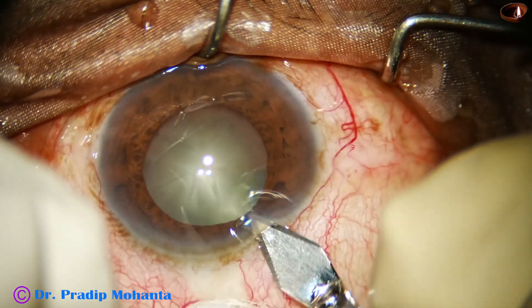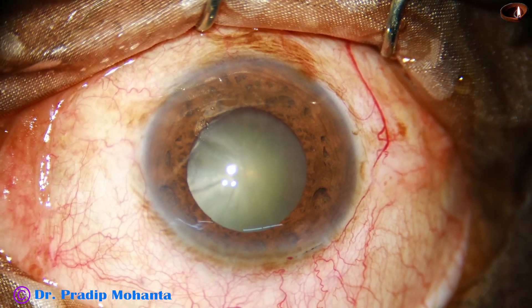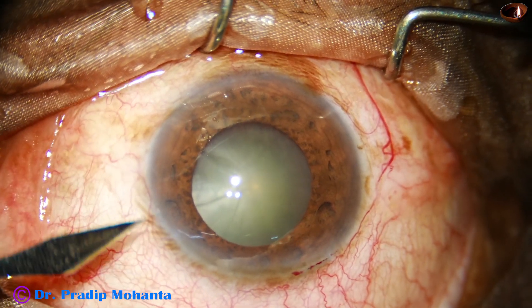This is the main incision with a 2.8 mm steel keratome. A side port is made on the left side of the main incision.